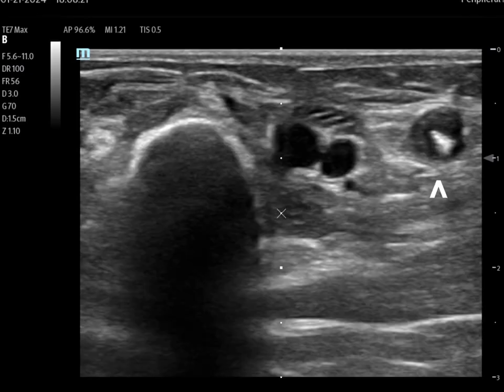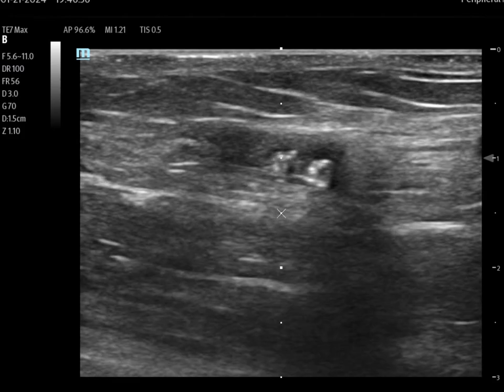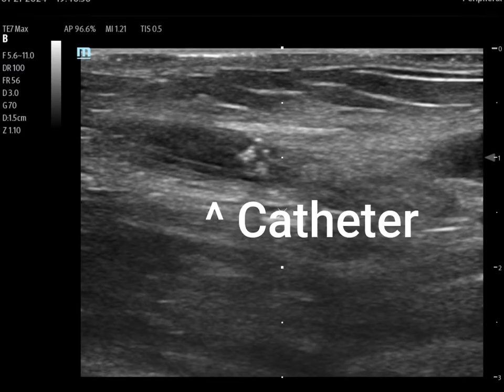In this image, I've frozen the picture, and you can see what looks like a hyperechoic structure inside the basilic vein. That's actually the catheter that was inserted through the thrombus. In this clip, we have the probe oriented in longitudinal view, and we can very clearly see the catheter inserted into the thrombus.